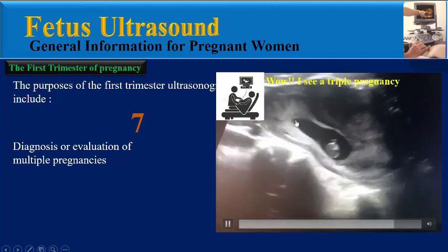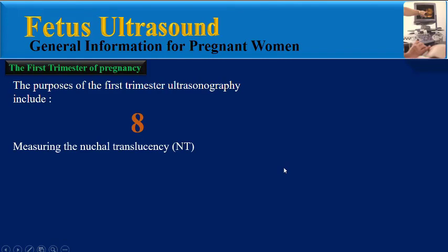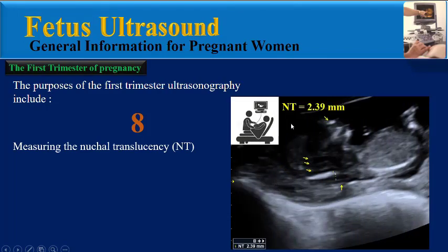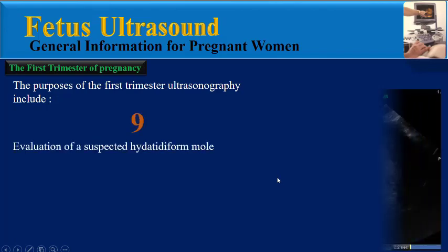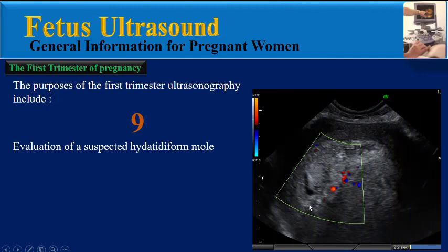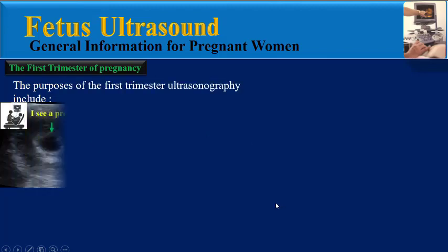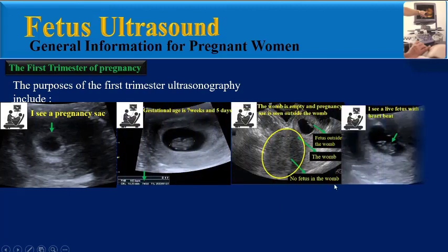The seventh purpose is the diagnosis or evaluation of multiple pregnancies, like this clip where we can see three pregnancy sacs in the womb with three live fetuses — the physician reports: I see a triple pregnancy. The eighth purpose is measuring the nuchal translucency, like this image where the physician reports: nuchal translucency is equal to 2.39 millimeters. The ninth purpose is evaluation of a suspected hydatidiform mole, like this image where the physician reports: there is no fetus but a hydatidiform mole is seen. In the following videos I will explain all these items in detail and completely.